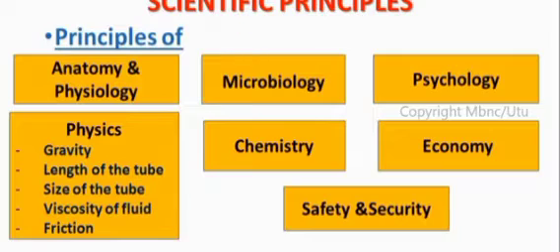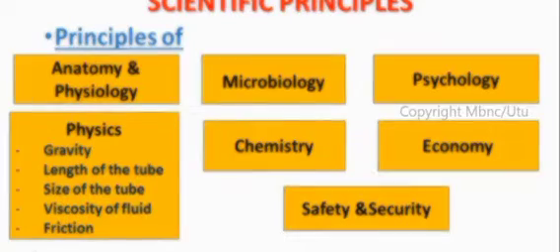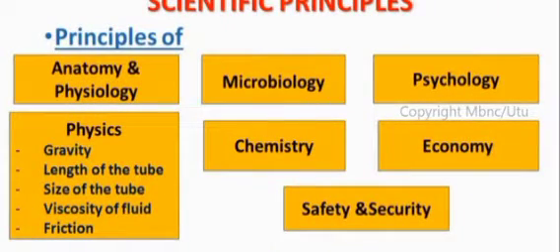Regarding friction, when we are inserting the NG tube, we apply lubricant jelly. Because of the lubricant jelly, less friction will occur, and because of that NG tube insertion will be done easily.